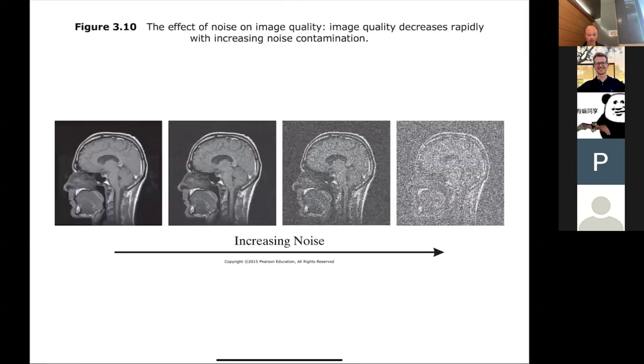All right. So the next topic I want to get to is noise and how that relates to some of the other parameters that technicians set on the console. I think you saw this in a previous lecture that Professor McVeigh gave, which is that when you acquire an image, you do have to worry about how much of it is signal and how much of it's noise. Typically, there's always going to be a trade-off, right? If you have something with no noise, it's going to take you forever. And if you do it too quickly, you might have too much noise. So in practice, the clinician has to decide on the right trade-off. We'll talk a little bit about some of the trade-offs they might make.